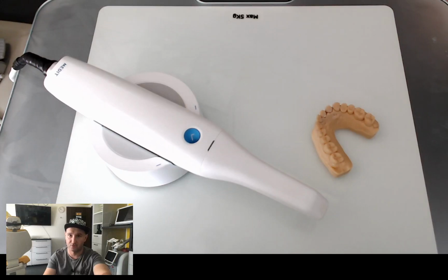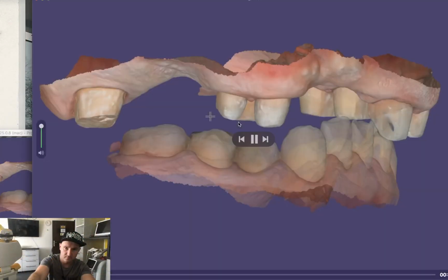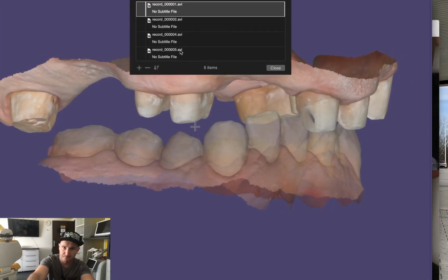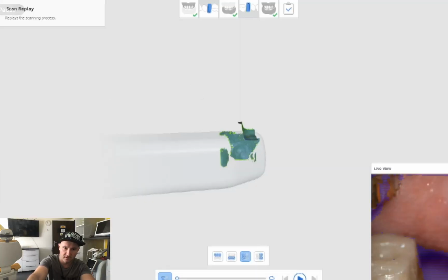Second thing that you need to take into consideration is, I will just switch into video, just give me a moment, scanning of your occlusion, because in all scanners you are able... moment. Okay, here we go.